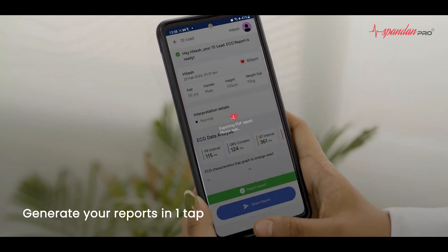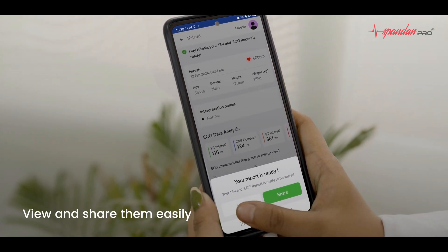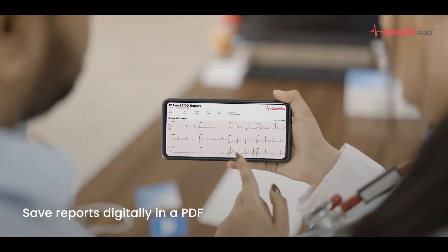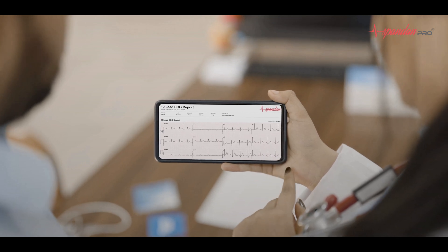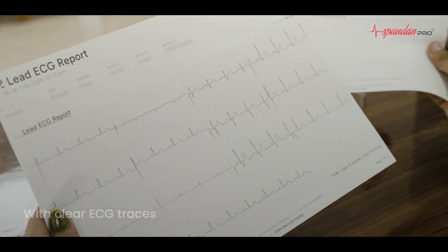Generate your reports in one tap. View and share them easily. Save reports digitally in a PDF. Get A4Sci's easily readable reports with the clearest traces.